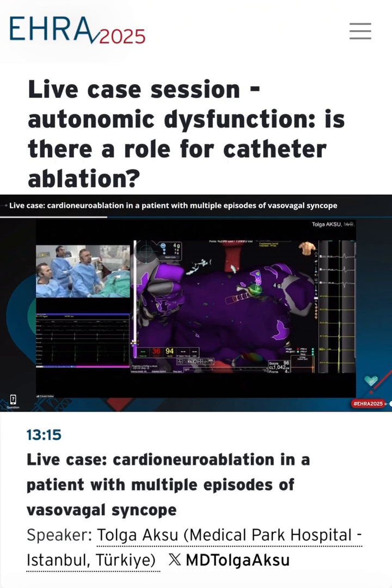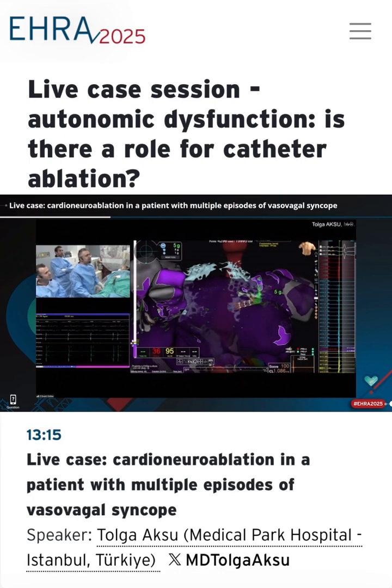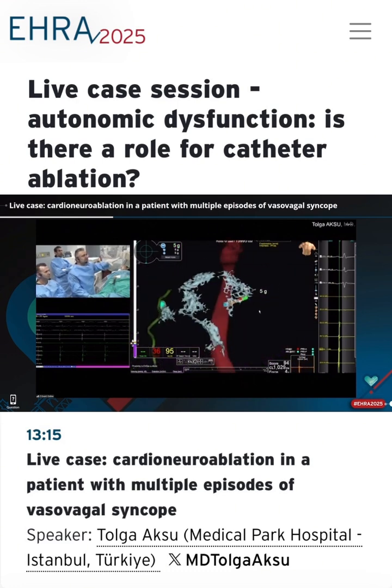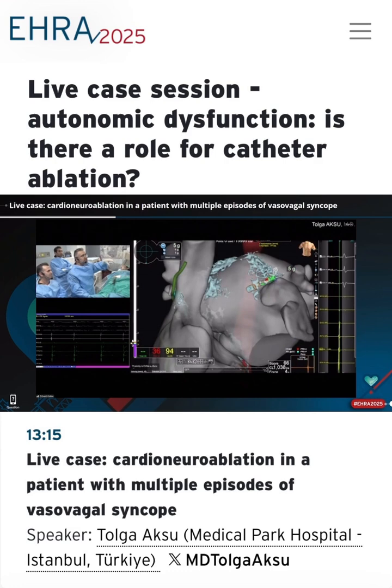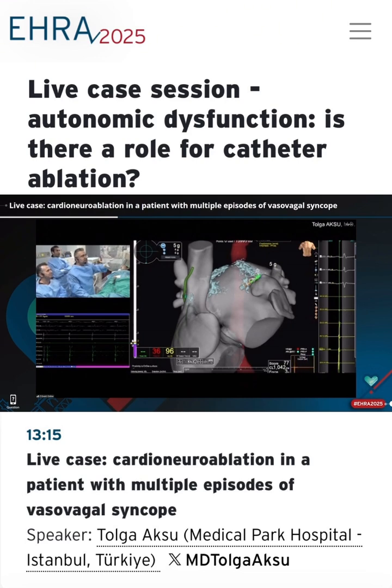Let's see what we are seeing in CT in that area. Can we increase the translucency of left atrial map? Yes. Please remove the 3D map. Remove the left atrium and right atrium 3D map. We'll just see CT distribution of GP. Can you add left and right atrial map on CT, please? Yes. You are seeing the distribution of epicardial fat pattern, of course GP, based on CT.